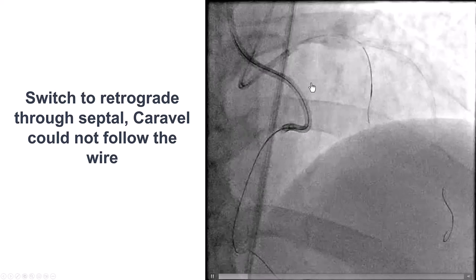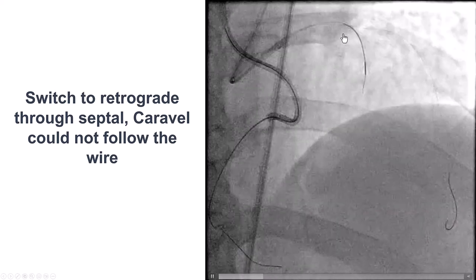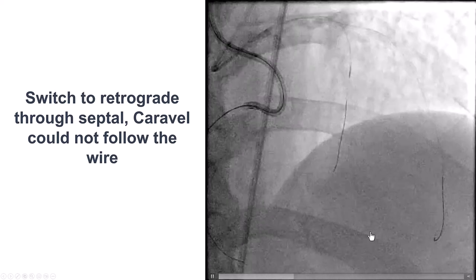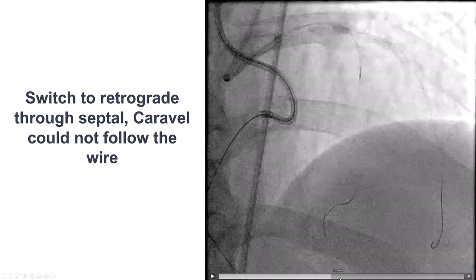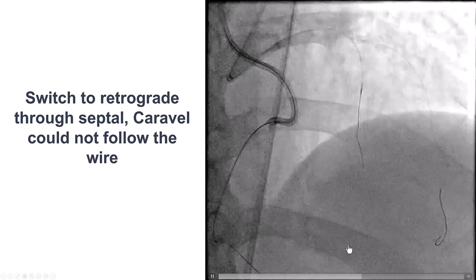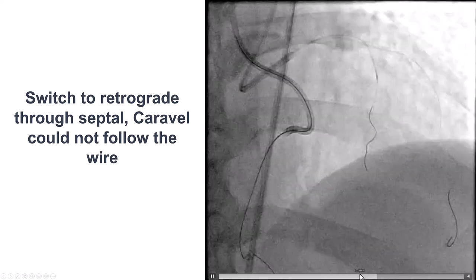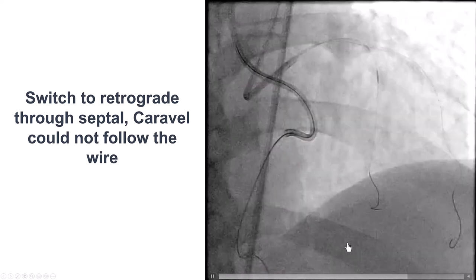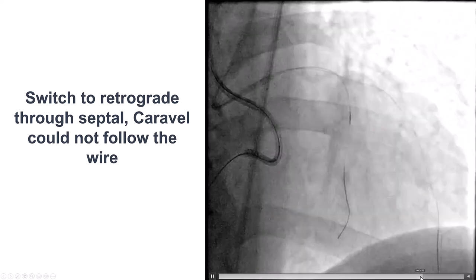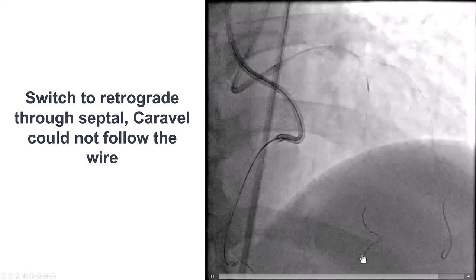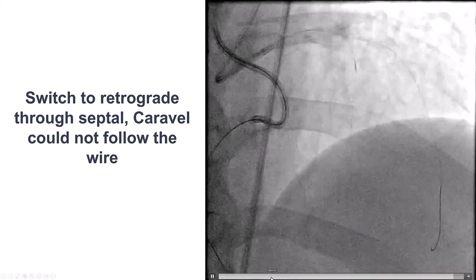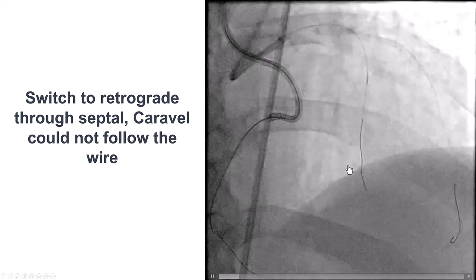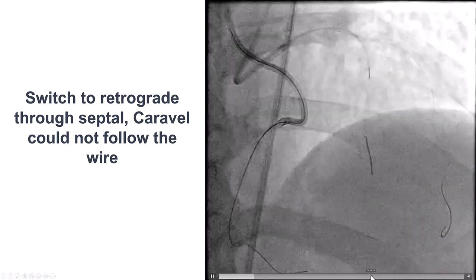After multiple attempts, we decided to switch retrograde. We tried through the septal branch, and after multiple attempts were able to advance the guide wire along a fairly tortuous collateral into the distal true lumen. Unfortunately, we could not get the Caravel microcatheter to cross, and in the process we actually lost the wire position.